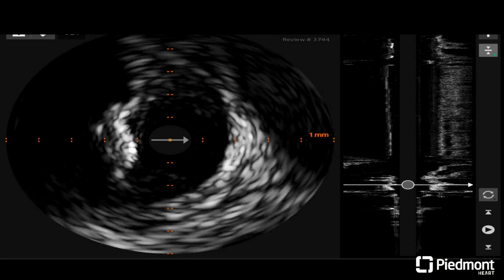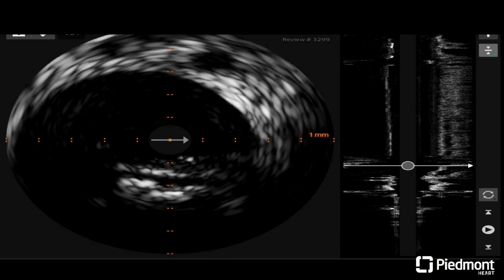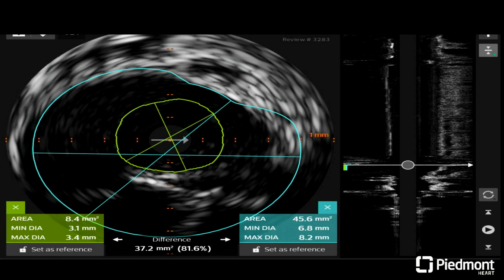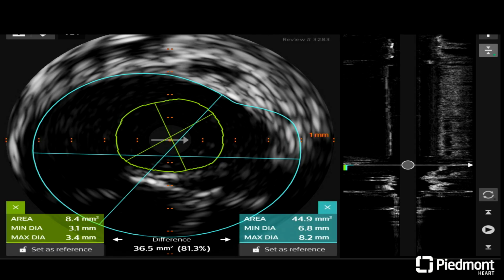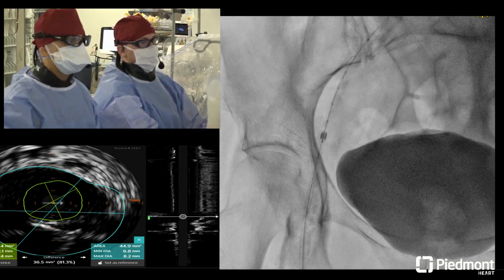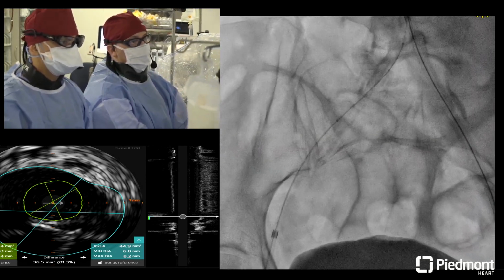I have to ask the question: in this small woman who's under 100 pounds, with heavily calcified diffuse disease, are we better off undersizing? I'm kind of scared I'll go too big using the IVUS. Yeah, less might be more. If you're using covered stents, you're not going to get in too much trouble, but yeah, I'm definitely all about undersizing in this case. I normally don't do that, but I think in this case, less is more. We want to try to do the best we can, not hurt her, in the best possible fashion.